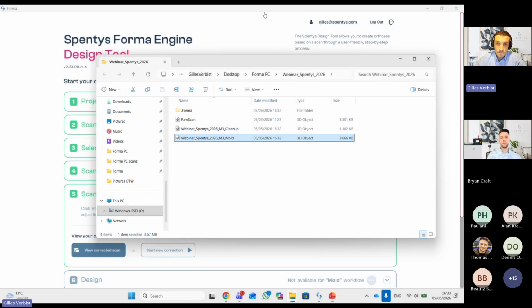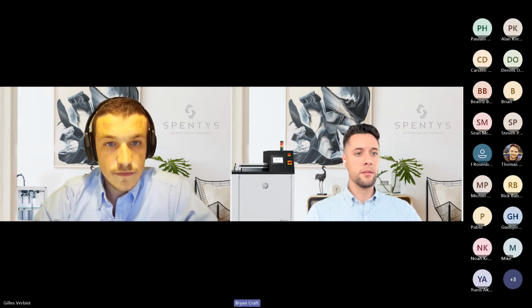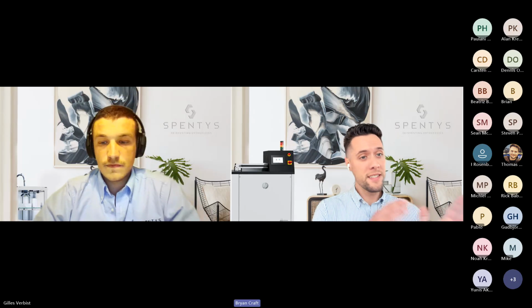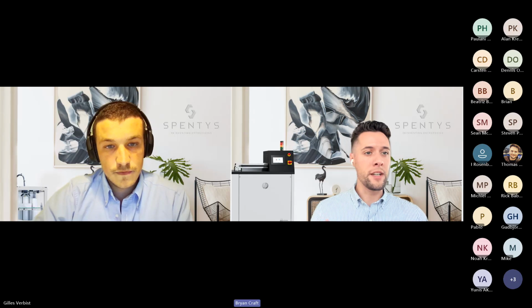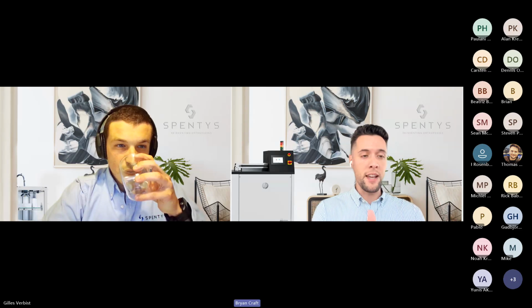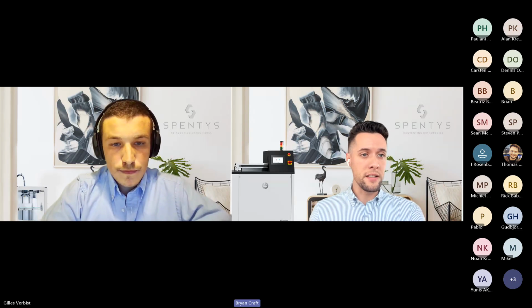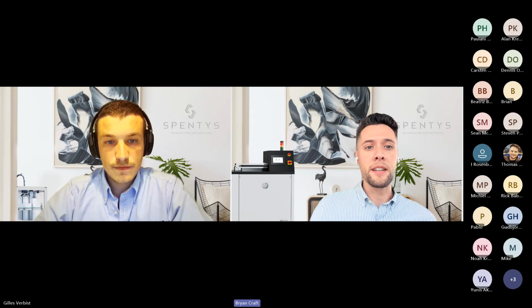So back to you, Brian. Thanks, Gilles. It's some powerful technology. What you just saw was a semi-automated process that many of the digital innovators have been doing manually for the last 10 years. Finally, today, we have a process that is simple, quick, and easy to be implemented within a 5 to 10 minute process.